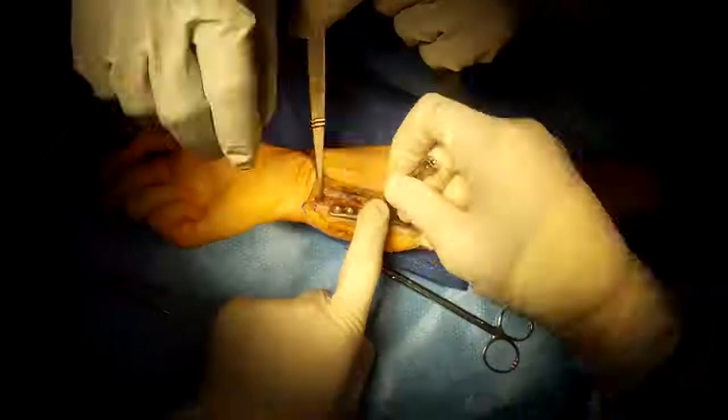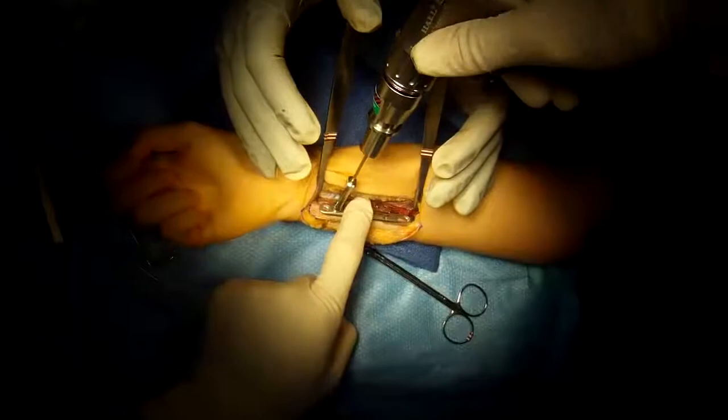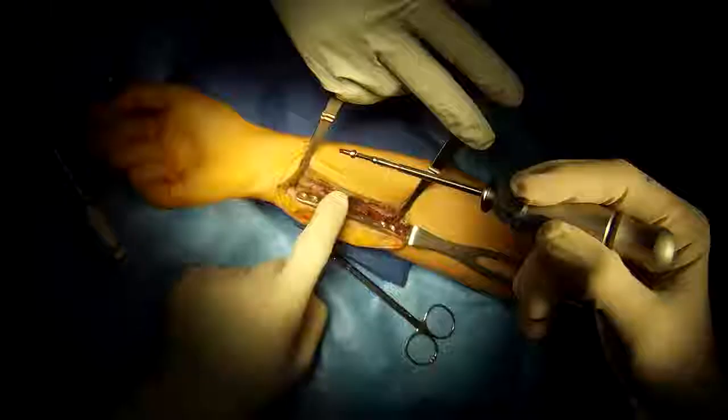Shortening the ulna takes stress off the triangular fibrocartilage of the wrist and also helps tension the lunotriquetral ligament of the wrist. This is a specially designed plate for this procedure, designed by my friend Tom Trumbull, who's a very famous hand surgeon.